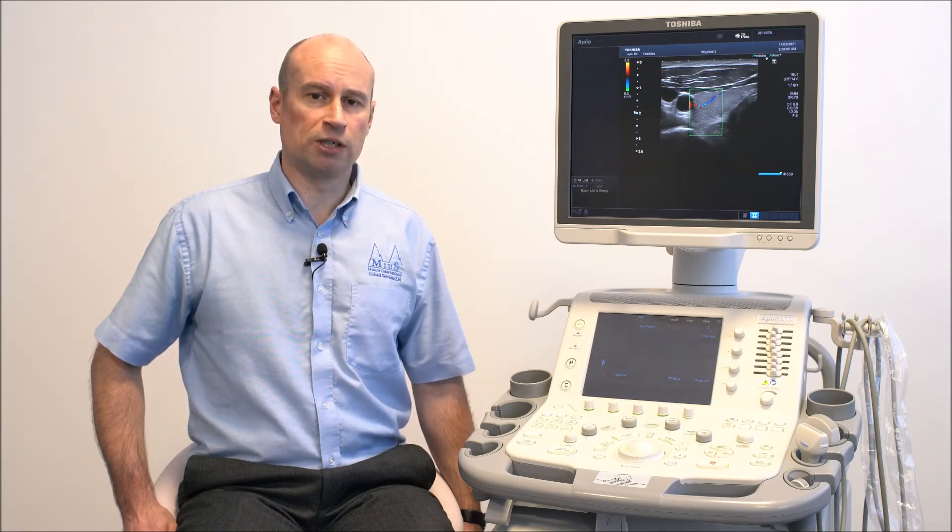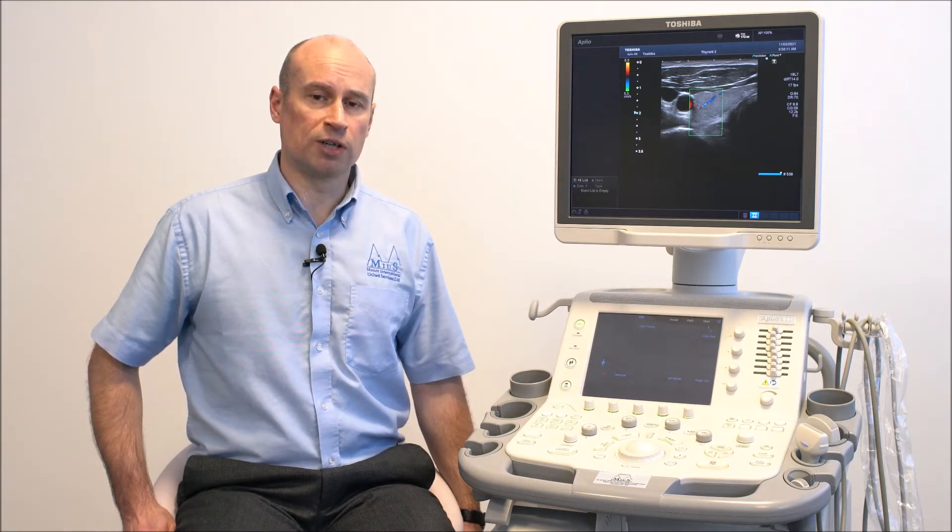The Aplio series offers outstanding image quality from a range of multi-frequency probes. Utilising linear, convex, micro-convex and phased array probes, you'll be able to carry out abdominal studies, cardiac studies and all the other studies normally associated with veterinary practice.